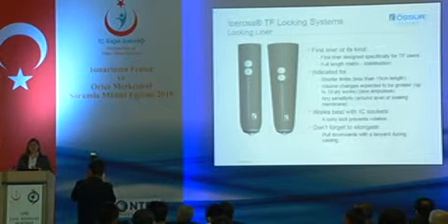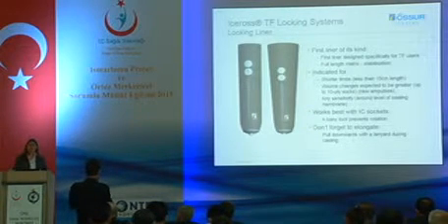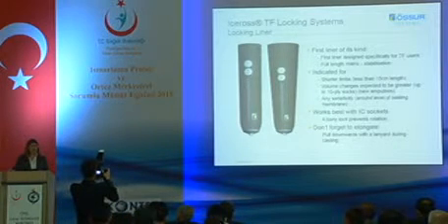However, you still have some amputees that can benefit from it. For example, somebody who is sitting down a lot and just wants to click their prosthesis into place, or shorter limbs where sealant isn't designed for.